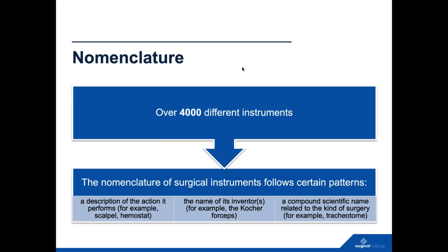Sometimes you'll see tape, sometimes you'll see where instruments have been color coded with a dipping process. And here in the US right now, that's a big no-no. A lot of the surveying bodies are hitting hospitals very hard for tape that's been applied to an instrument because it causes corrosion, and often it's not maintained. But yes, lots and lots of instruments.